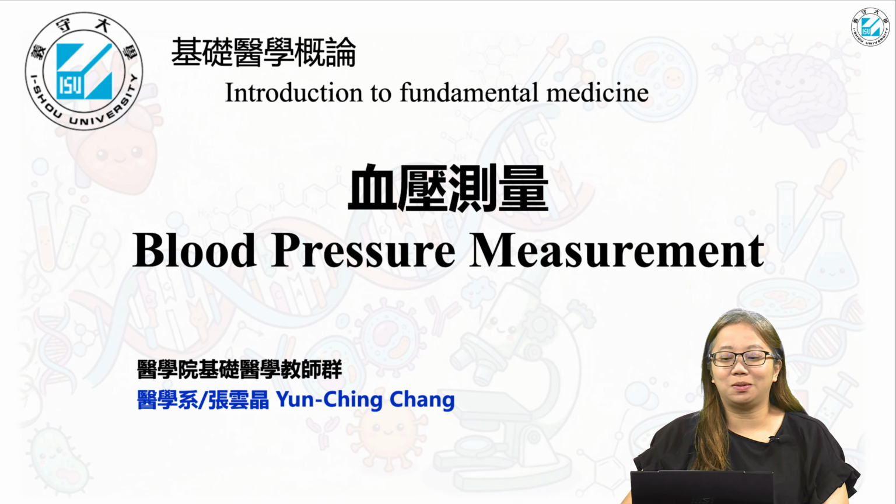In this lesson, we will learn what blood pressure is, why it is important, and how to measure it correctly. Blood pressure measurement is a basic clinical skill, but it is also very important for disease prevention and health monitoring. By the end of this course, you should understand the basic principle of blood pressure measurement and the correct way to use a blood pressure meter.